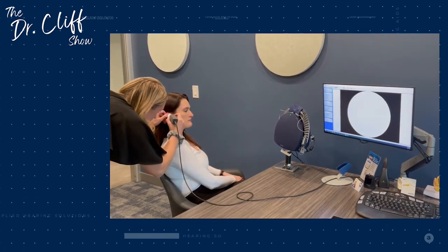You referenced yourself that one of the biggest issues is that they can't see it, but we have no way to remember what their ear canal looked like. Yeah. If you take an average clinic day, we are probably looking at between 10 and 20 ears, right? And if you don't see that patient again for another month or so, by that point, we've seen hundreds of ear canals. So not being able to compare a pre and a post image was previously a huge drawback of traditional otoscopy that has now been remedied by video otoscopy and being able to take photos. For sure.